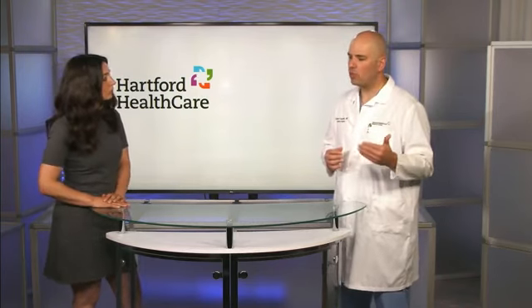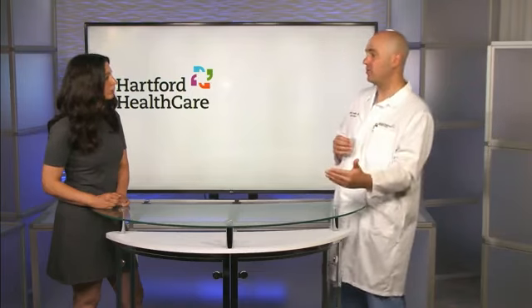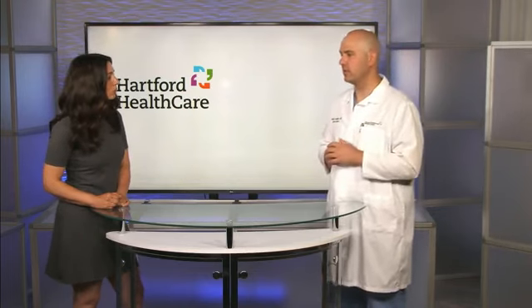But what we're seeing more and more is that the reason why we say that the bronchoscope can help us determine earlier stage lung cancers, and even those that don't have a solid component, again, just a slightly higher density, we call them ground glass opacities, typically associated with what we call minimally invasive cancers, is that perhaps the most appropriate thing would be to resect those lesions. Well, obtaining the biopsy is only one aspect of it, but we can also mark those lesions and remove them, even though you can never feel that there was any difference in that lung tissue.